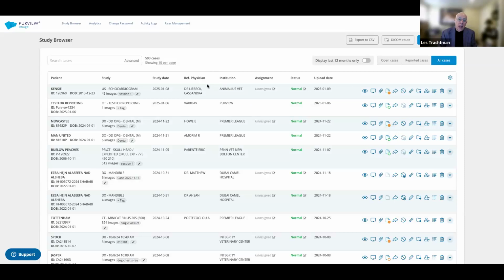We've had numerous clients and some recent prospects say to us that when they load a CD, which is mostly how they get images, all of the images on that CD likely pertain to the same case. When they load them, they may all be loaded in the system, but they're not tagged or identified as being with the same case. So you can't sort them back out easily. But with tagging, it gives you that opportunity to do that.